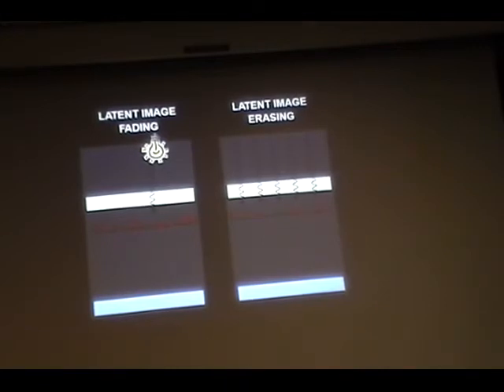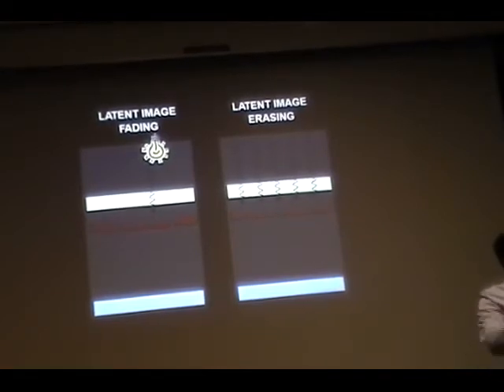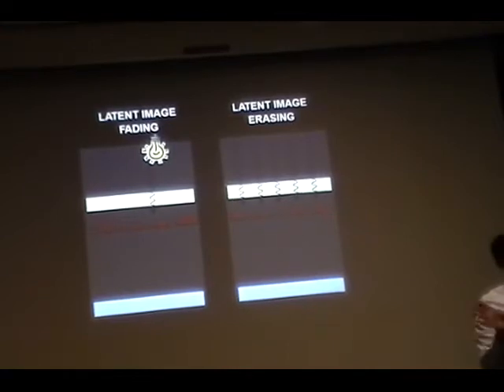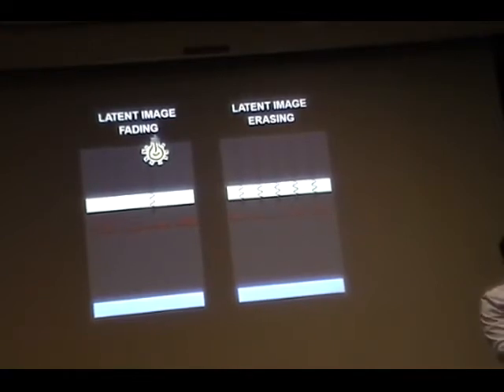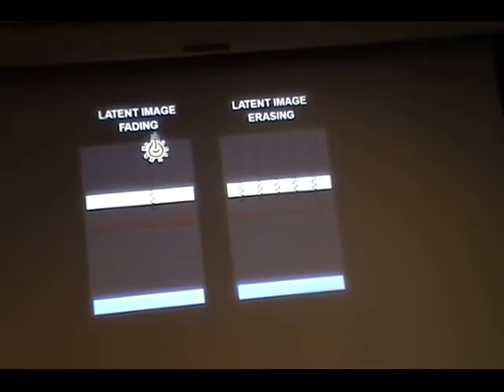So, you take one image and put it in the scanner, and even after you remove it from the scanner, if you take one more image without clearing, there will be double images because you have the previous image and the current image, so there will be overlap. So you have to make sure it is clear, so you keep it under light for 20 minutes so that it clears. Now with modern machines, the scanner automatically deletes it. So you have to check which machine you are using, whether it removes the latent image or not. 20 minutes.